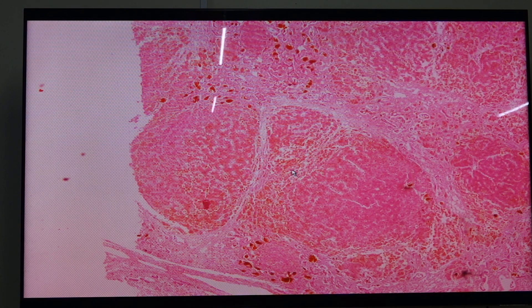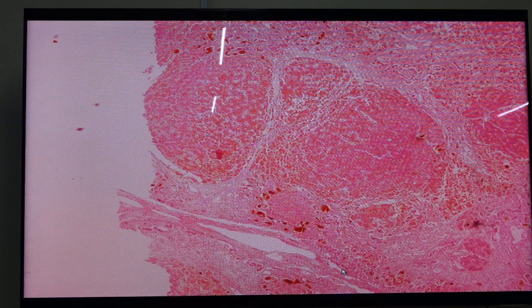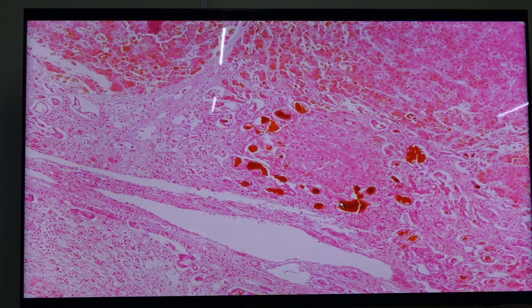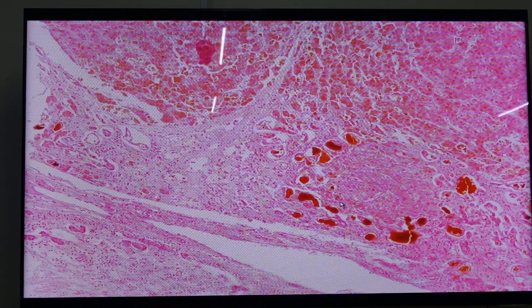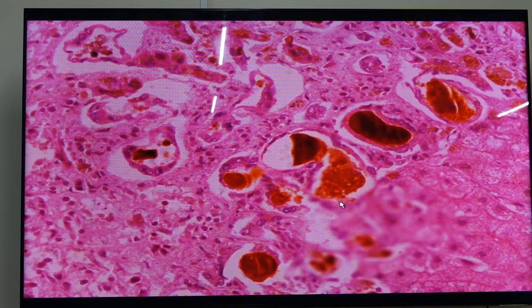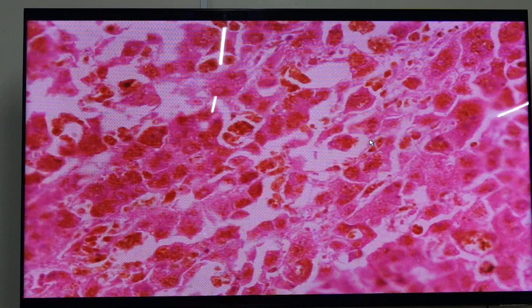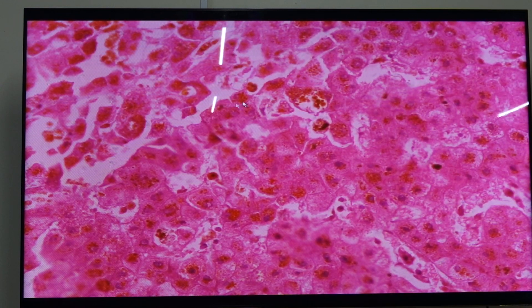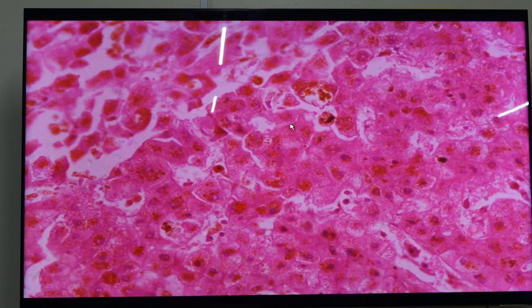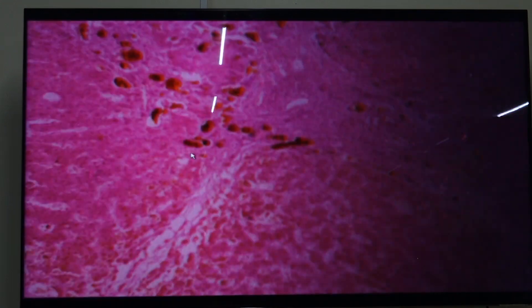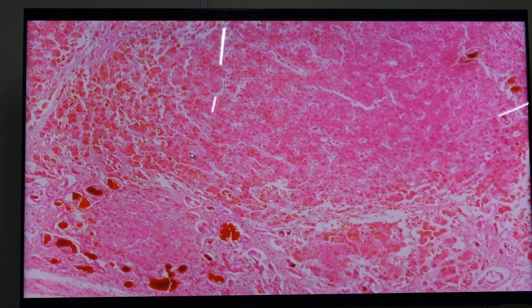Slide 183 is liver cirrhosis. You can see the presence of regenerating nodules surrounded by fibrosis. These structures here are called bile lakes. The dots within the bile lakes are bile ducts. If they are located within the parenchyma, these are called bile canaliculi. Notice the presence of bile pigment accumulation within the cytoplasm — this is a sign of marked or severe cholestasis.